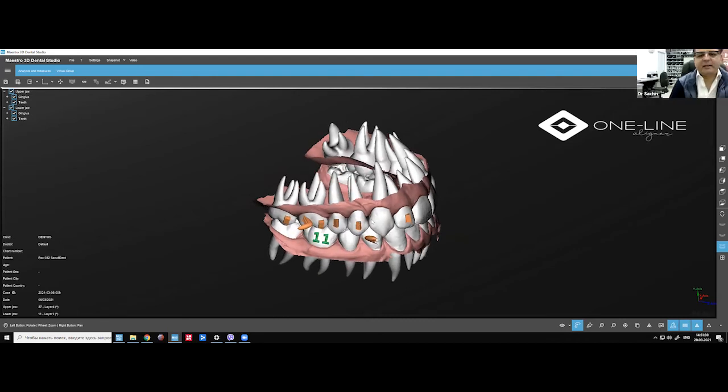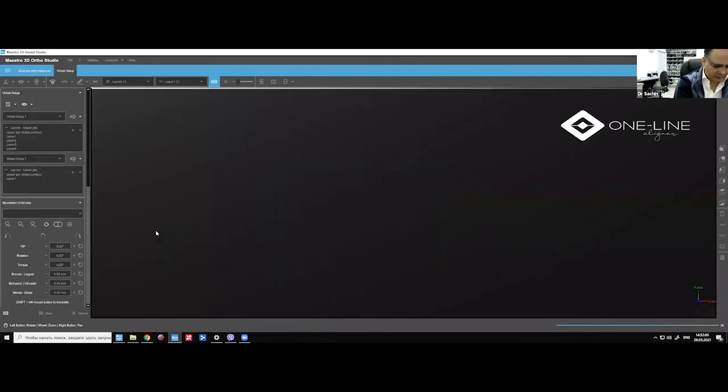No, I said that we have made some changes to the attachments so that in the aligner, we will get the hooks. So I just want to show you here. Yes, you can use it for class 2 and class 3 both. You just need to change the place and you can use it. Here, I'll just show you, and I'll send everybody what we did to change.